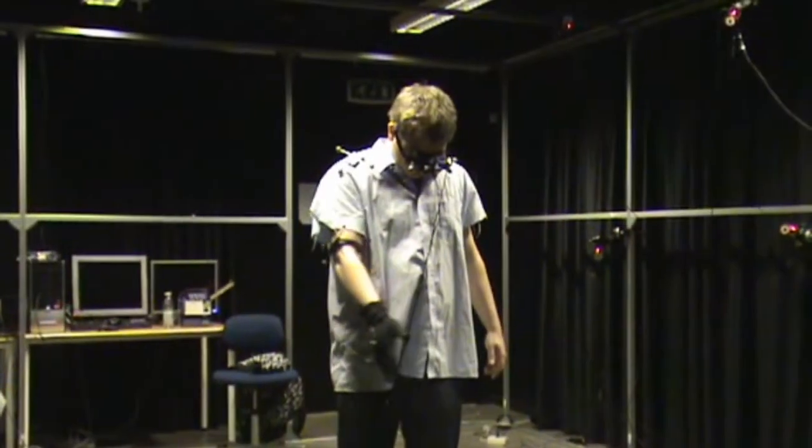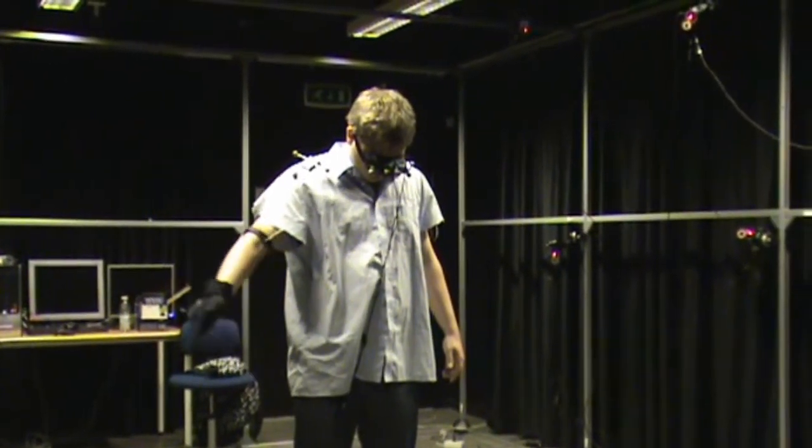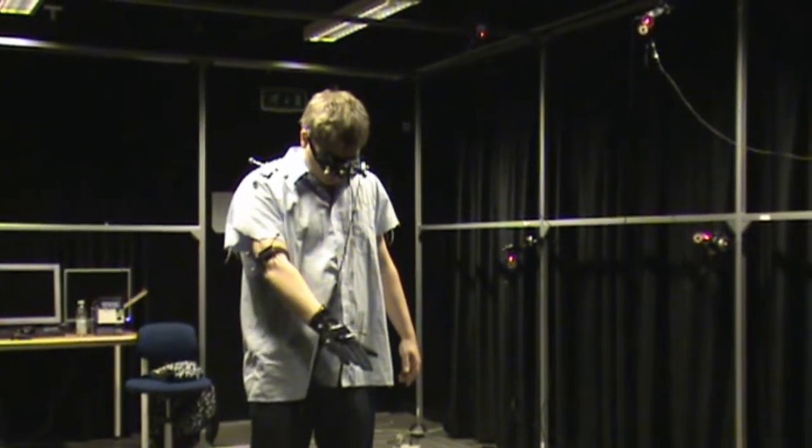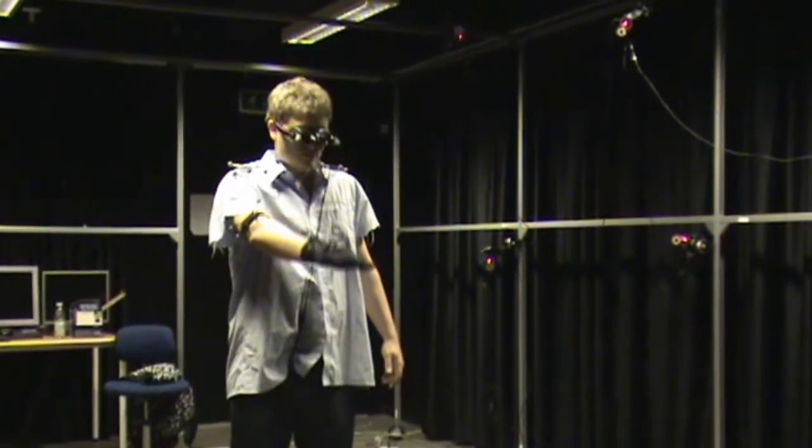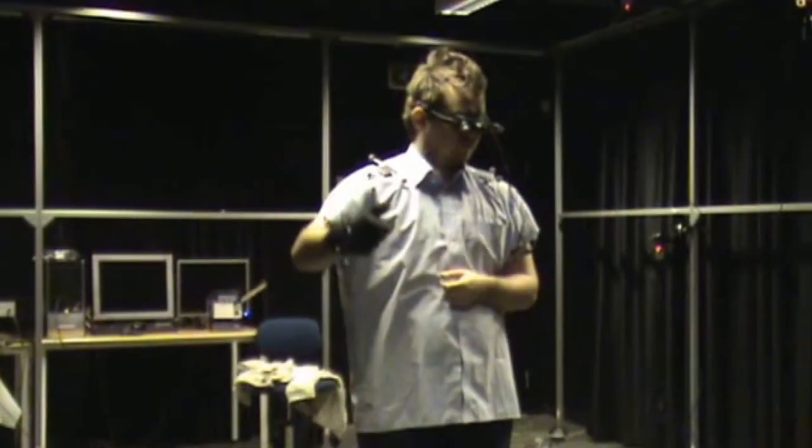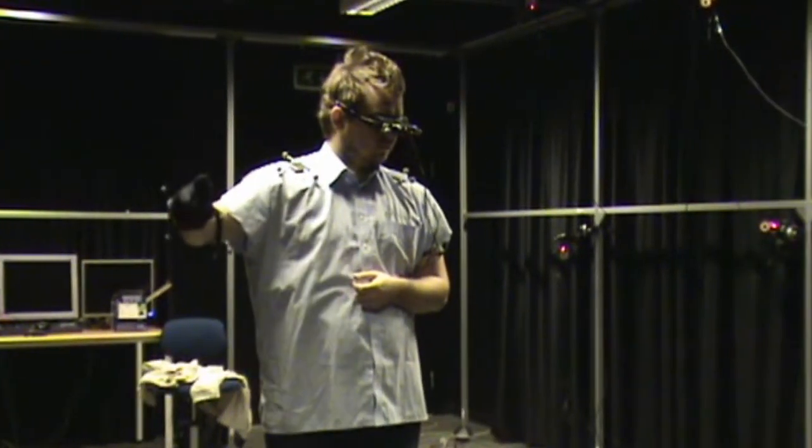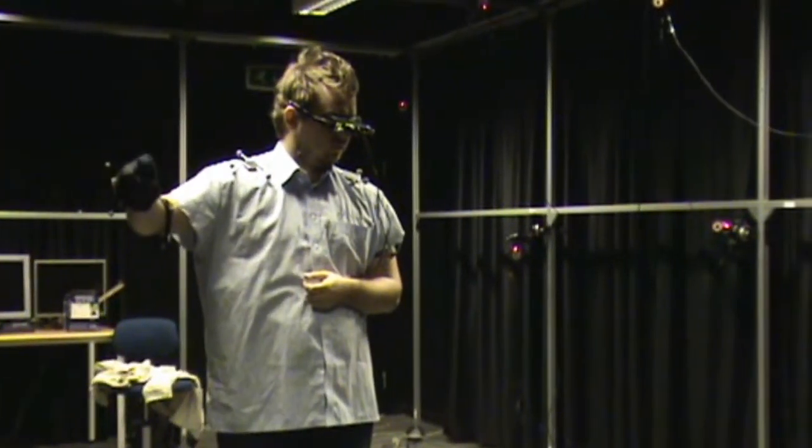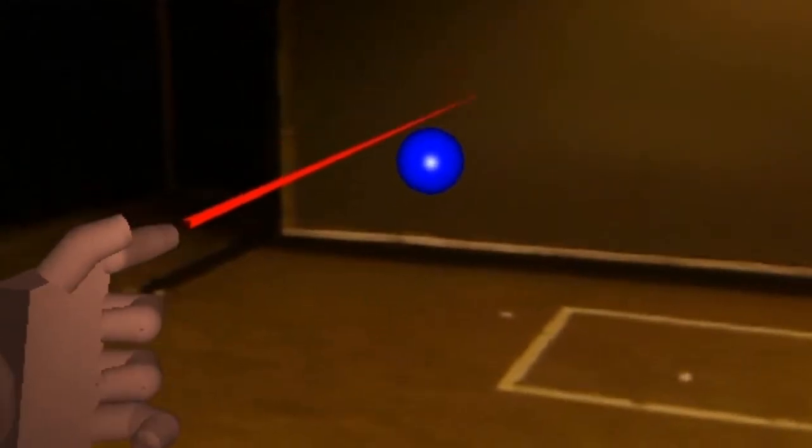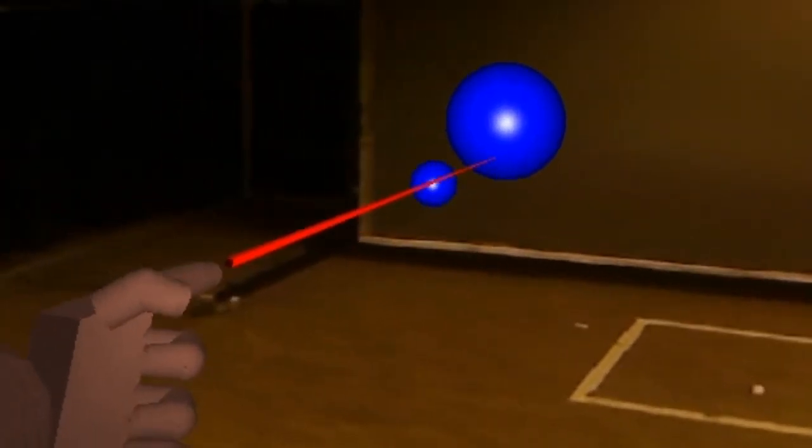Using healthy subjects, the augmented reality setup was compared to traditional mirror box treatment. Although the setup is in the early stages of development, it was able to create an acceptable mirror illusion and all test subjects preferred the augmented reality setup. The test also showed that the game improved the subject's motivation to use the treatment.